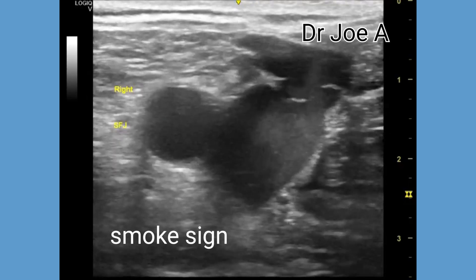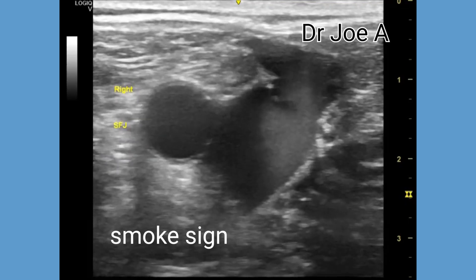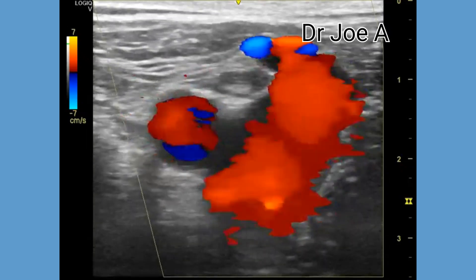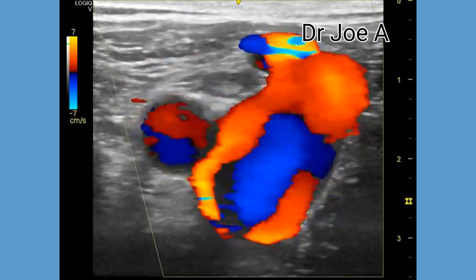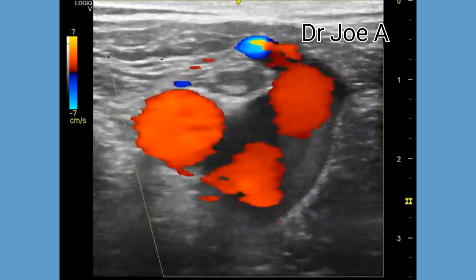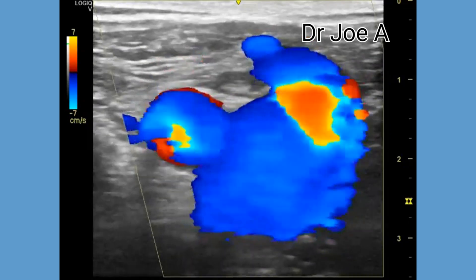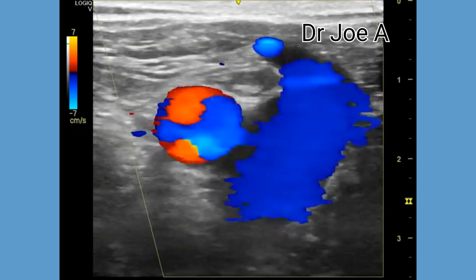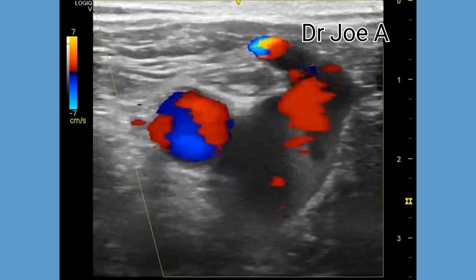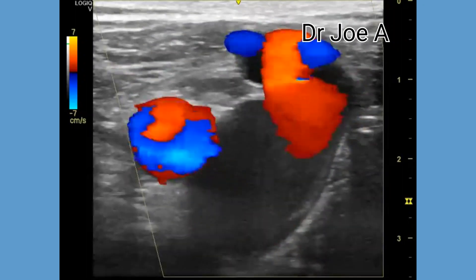The significance of the smoke sign is that it can help identify the location and the extent of venous insufficiency in the saphenofemoral junction. The color Doppler ultrasound of the saphenofemoral junction also shows severe turbulent flow within this region. On color Doppler of the saphenofemoral junction, there is forward flow which is seen in blue color. On Valsalva maneuver, there is reverse flow seen as red color in this region.